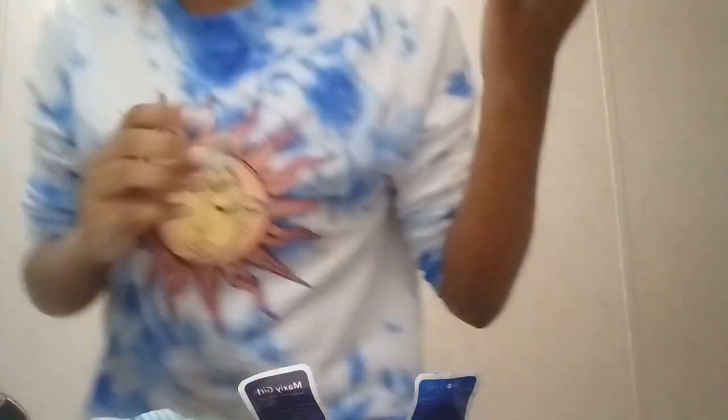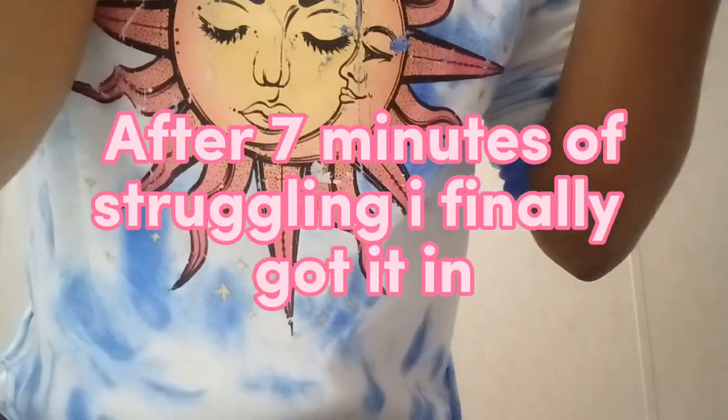I'm gonna put this one in now. Shoot, I can't get it in. I can't get it in... I got it in! Finally, I got it!